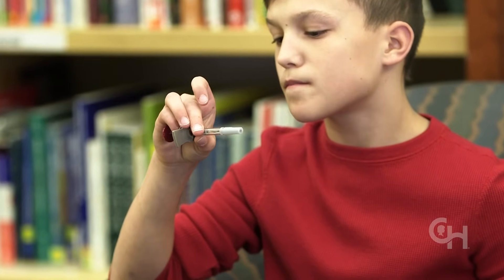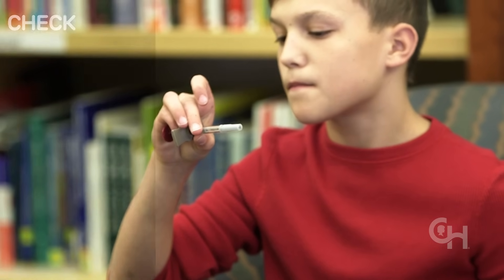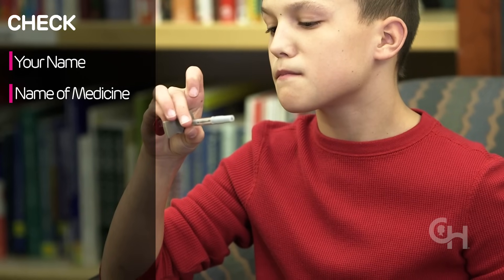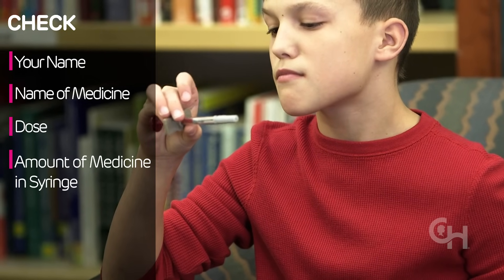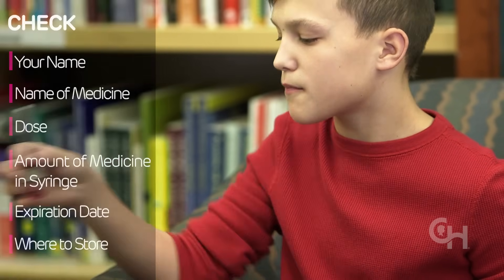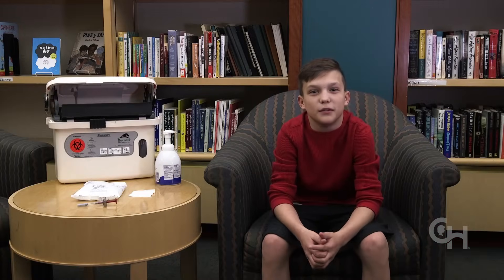Read the label on the syringe every time you prepare the medicine. Check the label for your name, the name of the medicine, the dose, the amount of medicine in the syringe, the expiration date, and where to store the medicine. Remember, it's always okay to ask an adult for help.